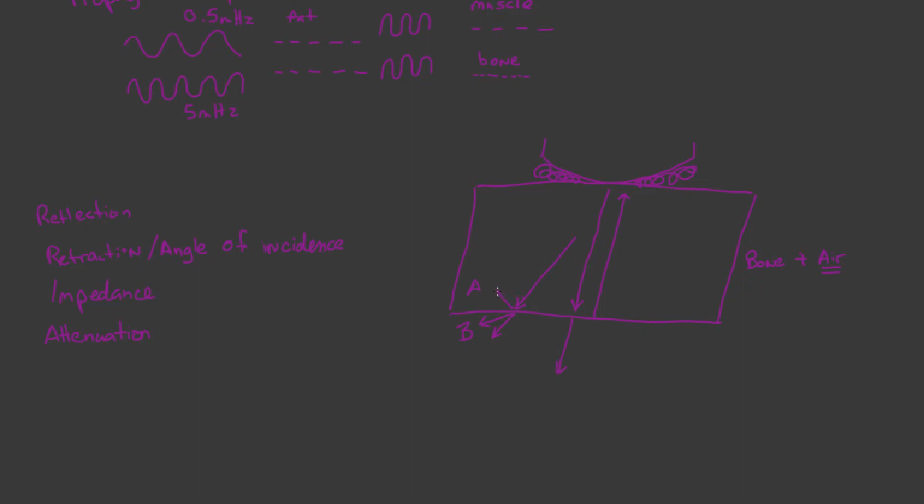Likewise, because of the angle, some is going to get reflected back into space, and that will become important in a couple of the artifacts that we'll talk about in another lecture. So, again, this is an idealized situation where the ultrasound machine kind of thinks that everything's hitting the surface at a right angle, but really things are bouncing and bending. Now, fortunately, those rough surfaces really do help produce the images because the sound waves interact in so many unique ways that we get reasonably ideal images.